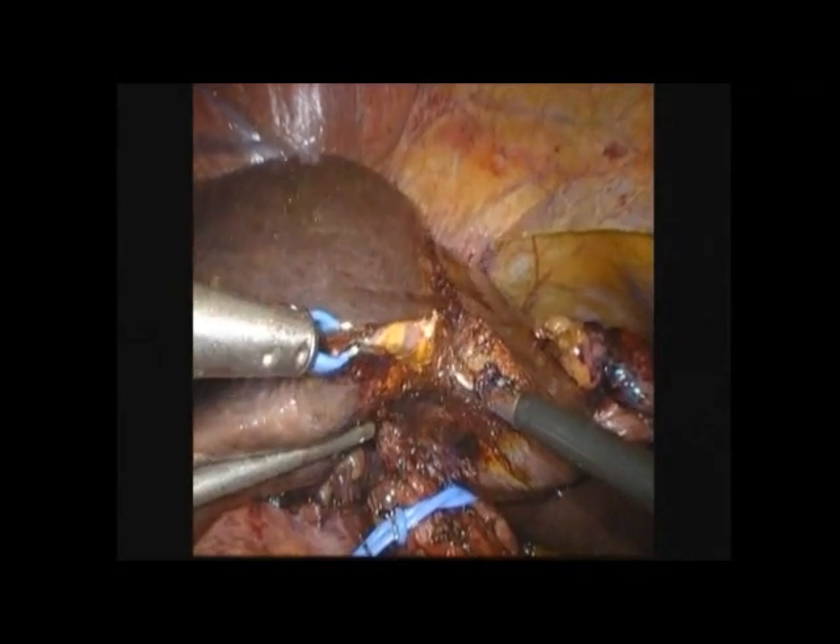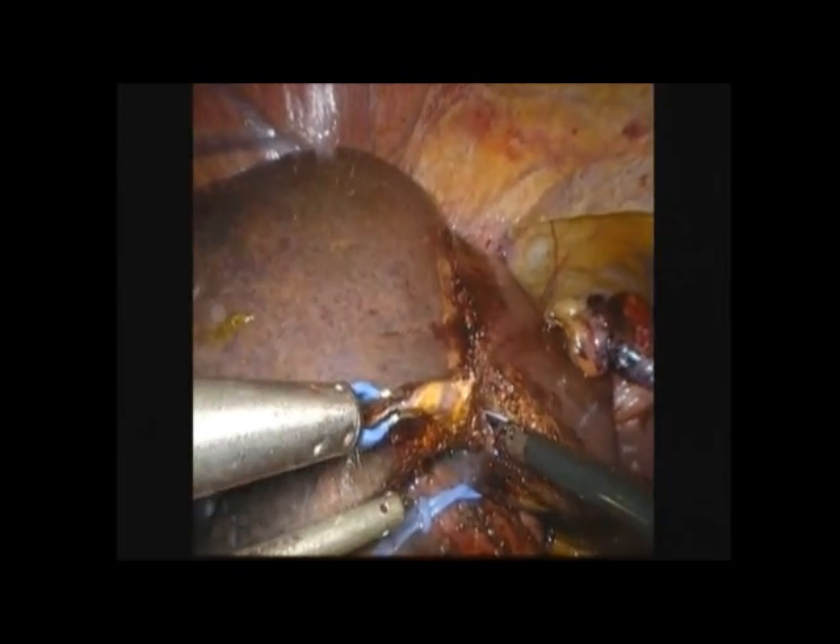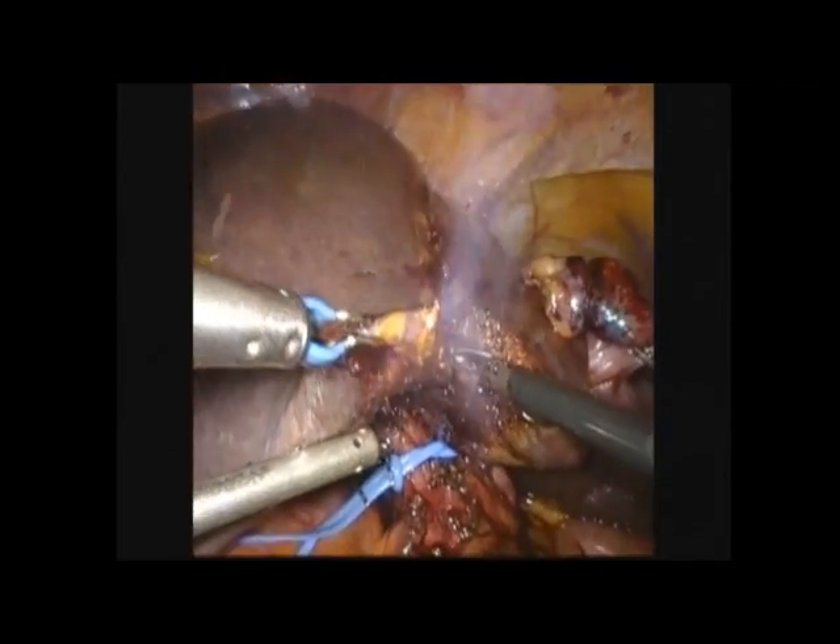Using coagulation devices such as a bipolar and harmonic scalpel, the liver parenchyma can be split. Note the blue loop, which is a laparoscopic Pringle maneuver.